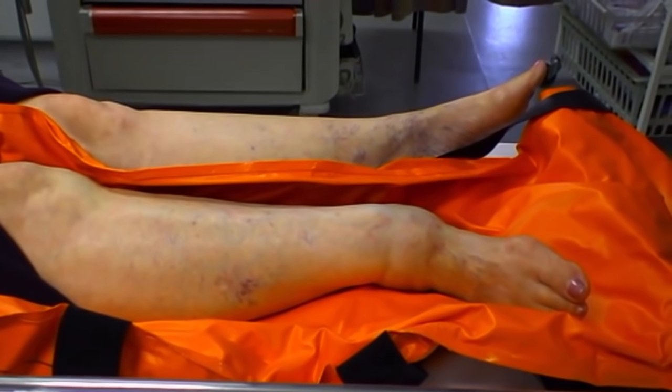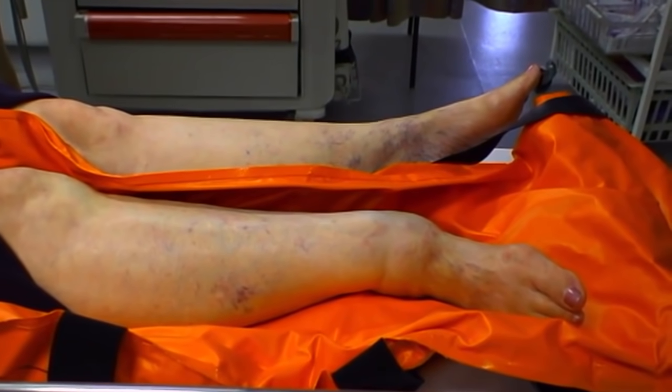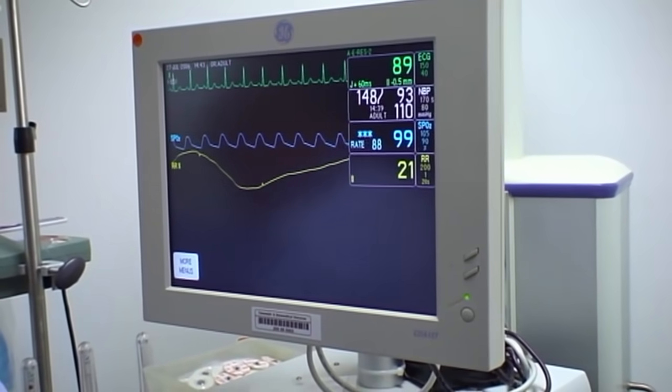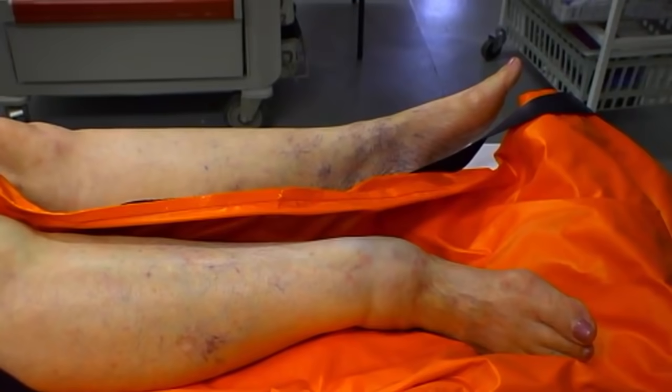We've taken a brief history and noted when she last ate. We have full monitoring on board and oxygen, so we're monitoring heart rate, oxygen saturations, and blood pressure. I also have two people assisting me — one person to concentrate on the patient while she's sedated, and another to help with the reduction of the ankle.